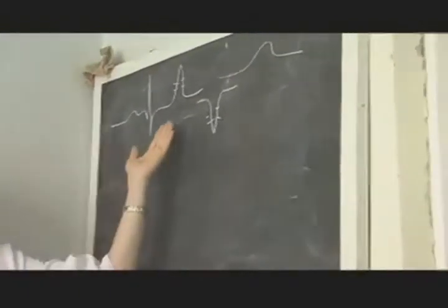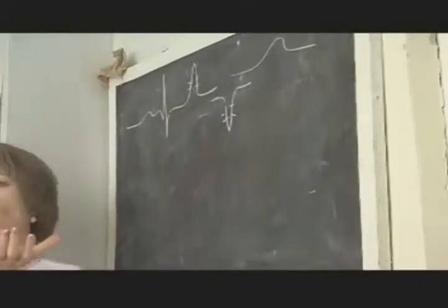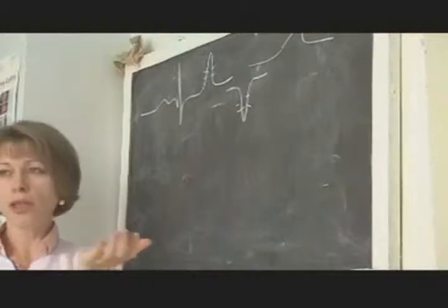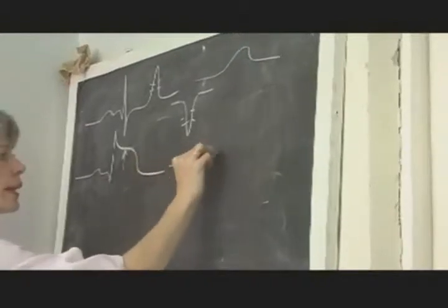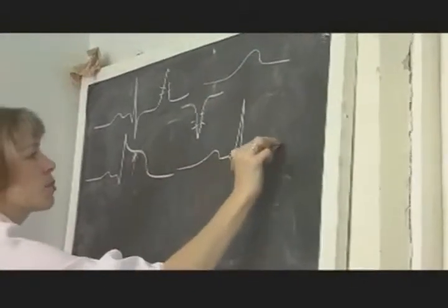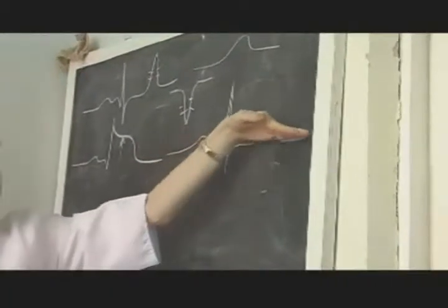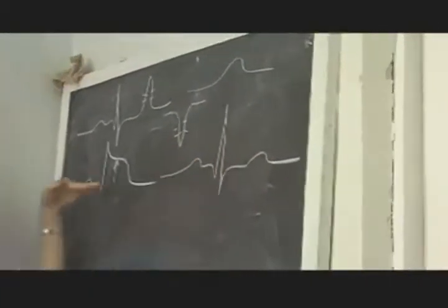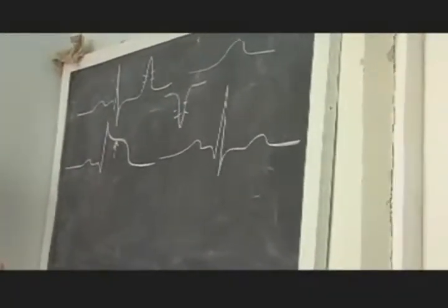If this process prolongs, you'll understand that heart muscles can no longer work without nutrition, and there will be damage of muscles. On ECG, damage of heart muscles is manifested with a rising ST segment. Normally, the ST segment must be isoelectric. It must be on the same level with the isoelectric line. We'll see the ST segment moves upward.